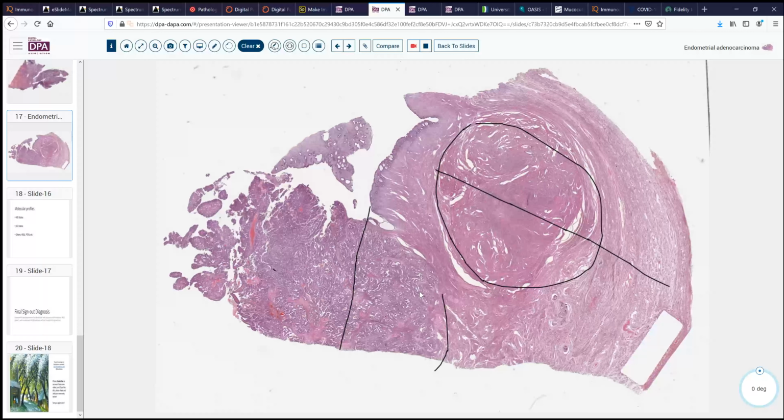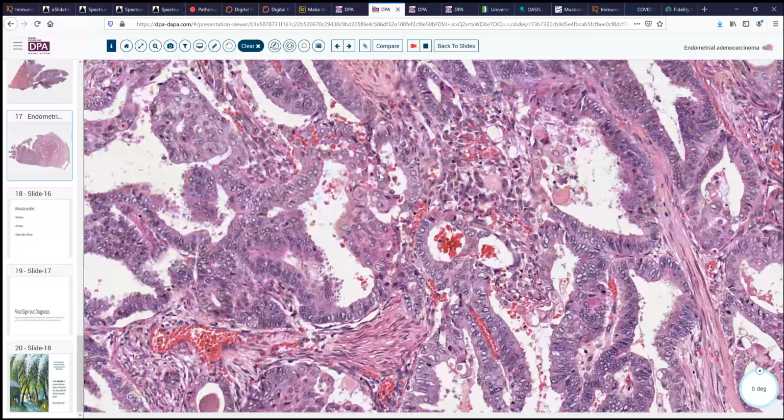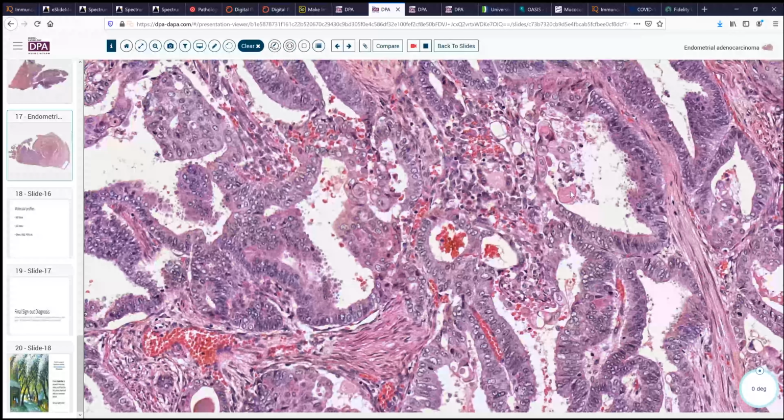Let's just take a quick look at this tumor and decide, are we looking at a grade 1 or a grade 2 tumor? Again, we have a lot of open space. Looking at our nuclei, they're mostly vesicular, a little bit more coarse in some areas and a few macronucleoli, but nothing worse than that. We do see we have some squamous differentiation here in this tumor as well. And so this is a nice example of a grade 1 endometrioid adenocarcinoma with just a little bit of squamous differentiation, all open glandular type tissue, all the way down here to the more deeply invasive component of the tumor, where we're seeing some more of this squamous differentiation, which we again would not classify as part of the solid growth.